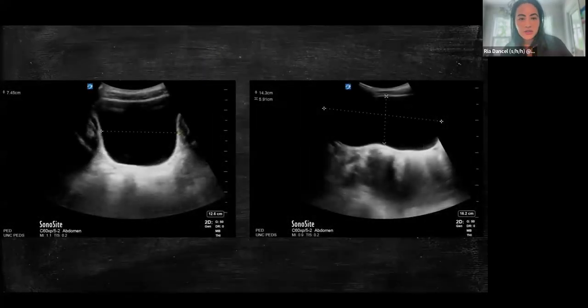I'm not going to make you do the math, and I'm not going to do the math online, with people watching me. So I did it previously, and it all comes out to be about 377, almost 400 milliliters, depending on the fudge factor that you use, which, if you're talking about an adult, doesn't sound so bad.